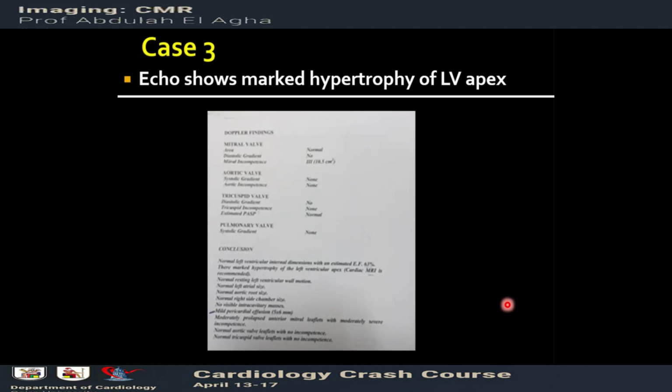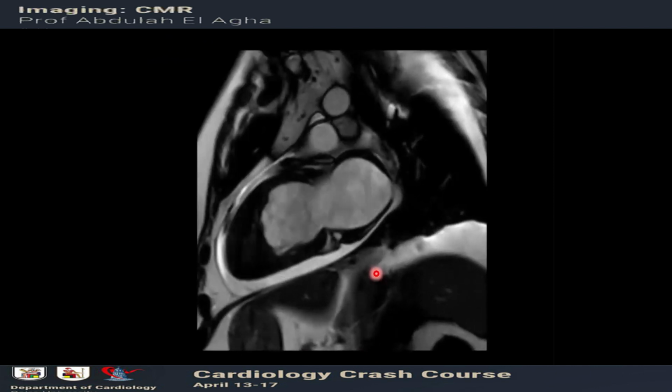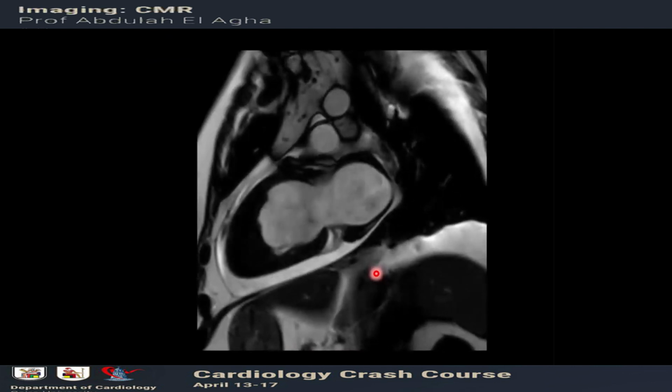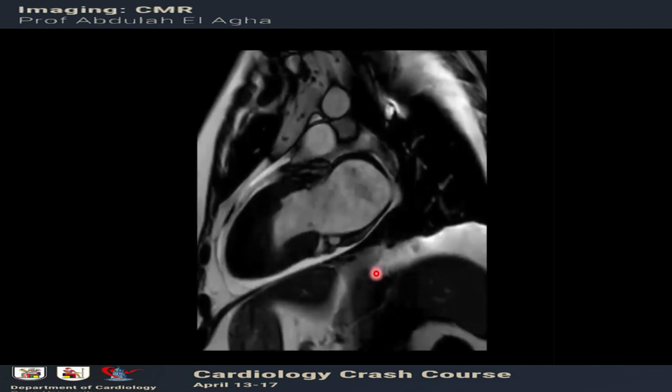echocardiography exams, and then finally one of the doctors said, okay, let's do cardiac MRI. He said cardiac MRI is recommended. I don't know why this patient is not improving while he is apical HOCM. So the indication here was to look at why the patient is not improving, although he is an apical hypertrophic cardiomyopathy, which would usually improve on beta blockers, right?